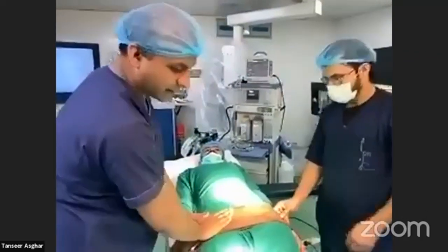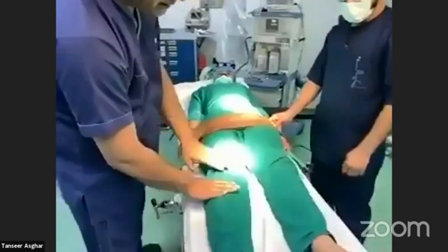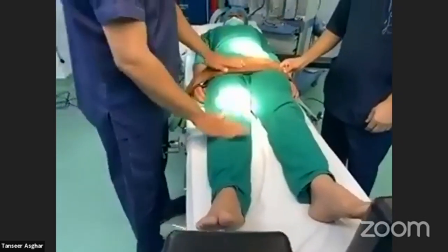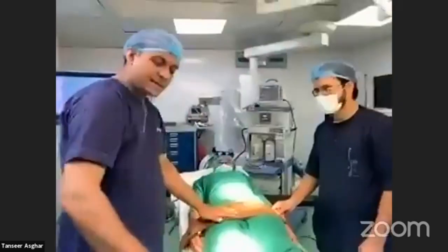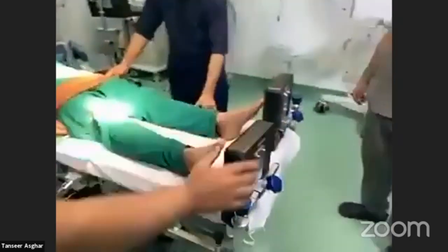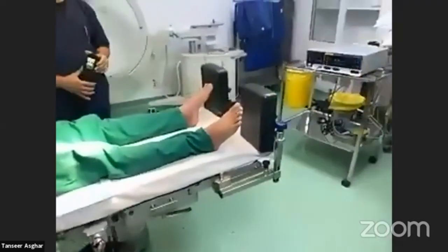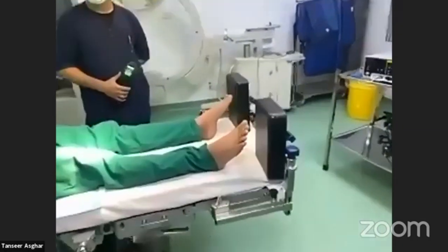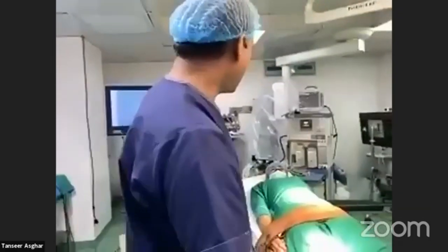The belt can also be tied just two inches below the knees. Here you can see the padded foot support, which is very important when performing a reverse Trendelenburg procedure such as bariatric surgery.